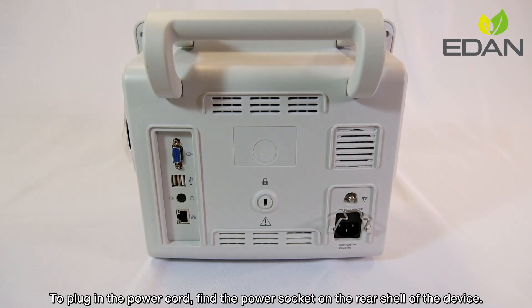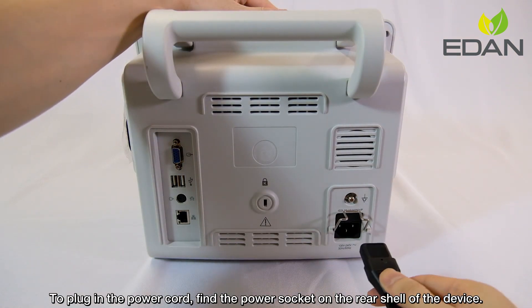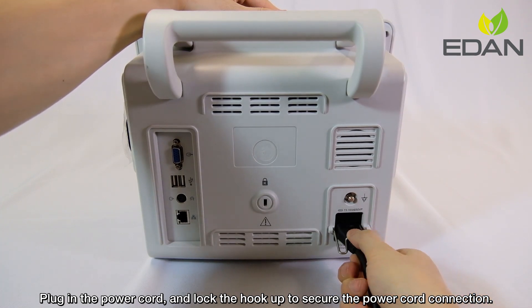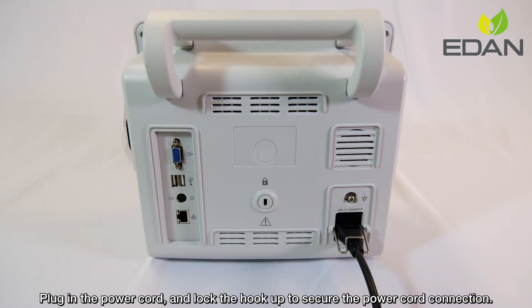To plug in the power cord, find the power socket on the rear shell of the device. Plug in the power cord and lock the hook up to secure the power cord connection.